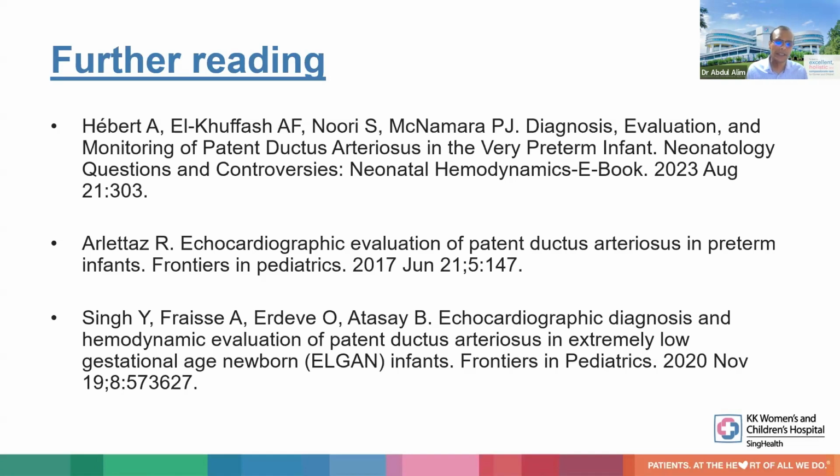If you need any further reading, this is quite a useful resource. You can take a screenshot and read a little more about those measurements. But the key is actually to practice it in your units, because even though I talk about this, it actually takes years of experience to get good views like that. For beginners, there will always be a bit of a challenge, especially getting good Doppler measurements.